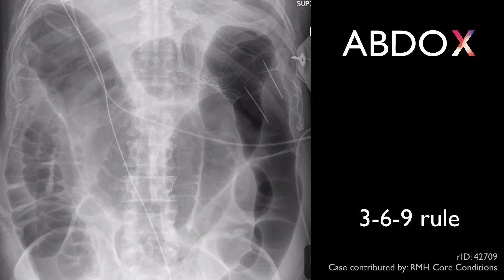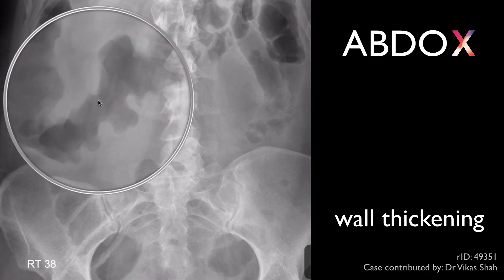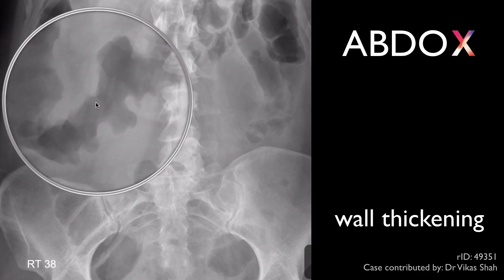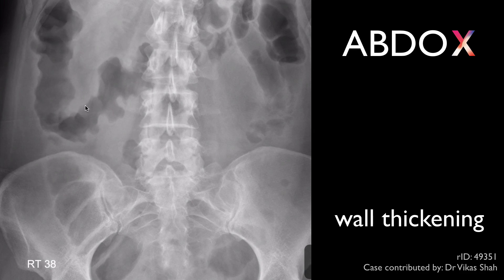Remember the 3-6-9 rule. This is a rough guide to the maximum diameter in centimetres of the small bowel, the large bowel, and the cecum. Bowel wall thickening indicates edema, and gives a bumpy appearance to the wall of the bowel, such as seen in the transverse colon here. This bumpy appearance is known as thumb printing.